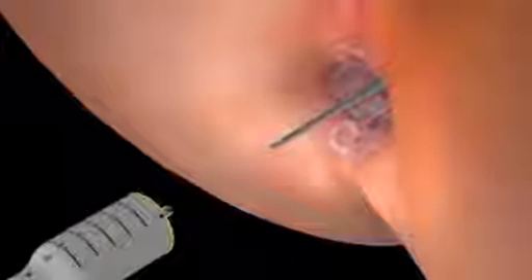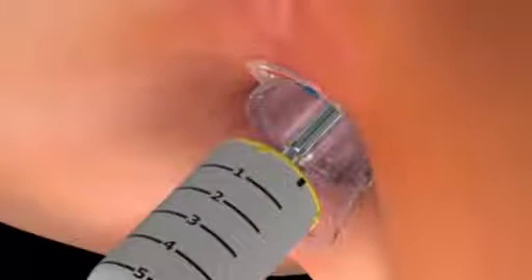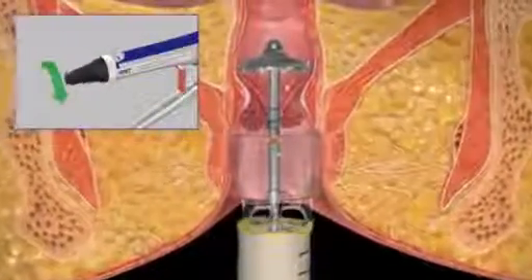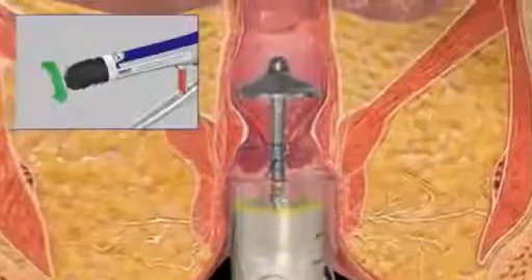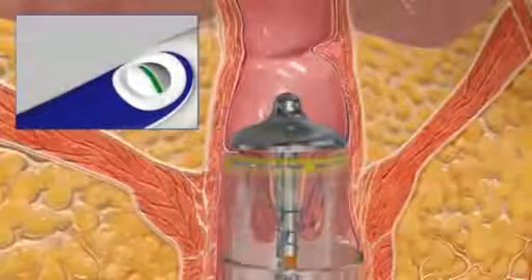To mate the anvil assembly with the instrument, fully extend the center shaft of the stapler by twisting the adjustment knob counterclockwise until it stops. Hold the center rod in one hand and mate the center rod to the stapler by inserting the blunt center rod into the female shaft receptacle. Push firmly until the center rod clicks into its fully seated position. Visually inspect the attachment to ensure that the center rod and stapler are fully mated. Close the device by holding it perpendicular to the opening of the anus and turn the twist knob in the clockwise direction. Allow the device to close with neutral tension. Continue to twist the knob clockwise until the ready-to-fire indicator displays a green line.